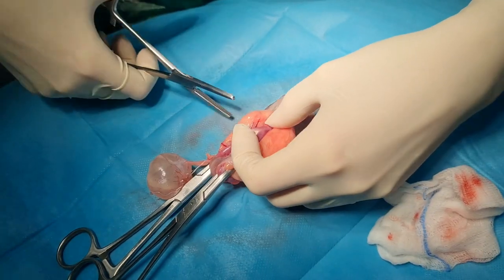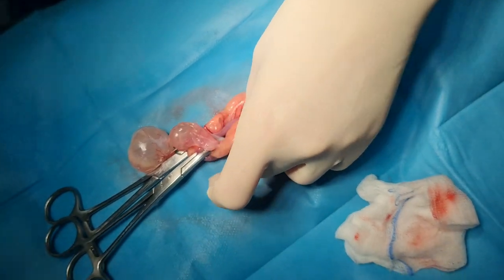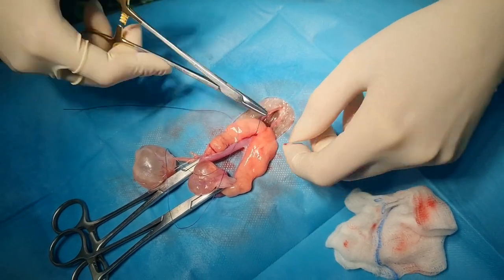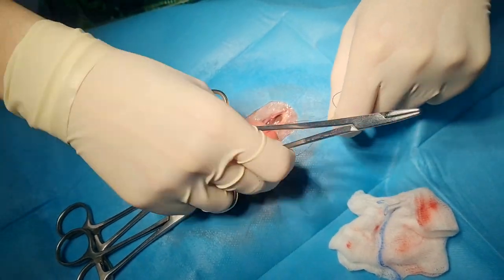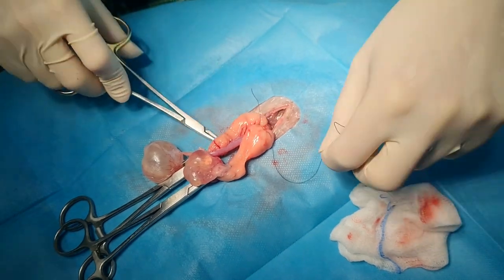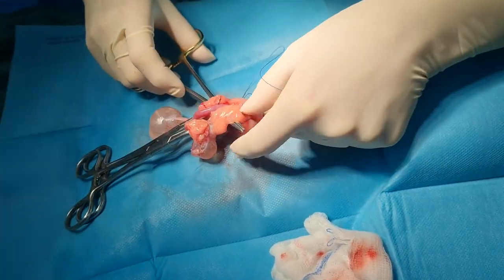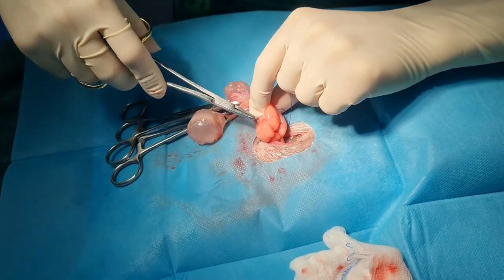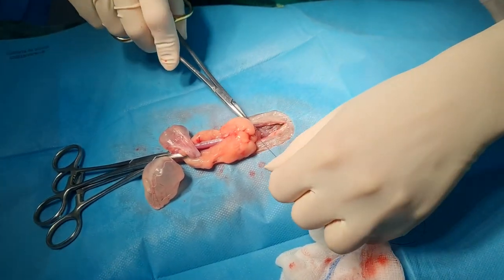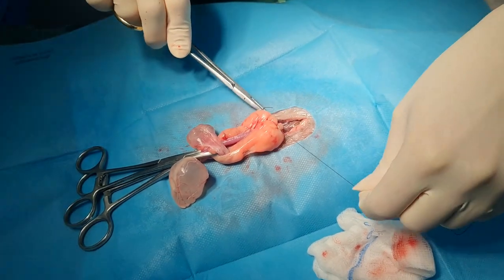I don't tend to dissect down all the fat because there's a lot of it, but actually she's very chunky there. These are a lot easier if you've got a younger animal rather than one that's massively hormonally active. Remember, most of our prey species prefer to lay down fat internally, which is why your older rabbit spays are usually really fatty and not very fun to do. Our rodents are the same. From a welfare point of view, this can make a massive difference to these little ladies.